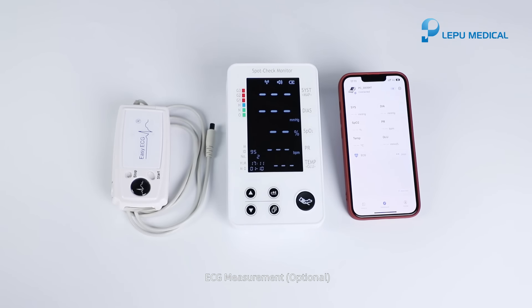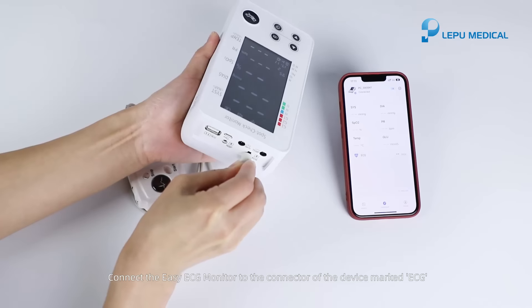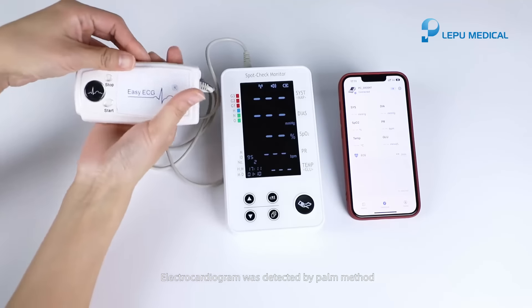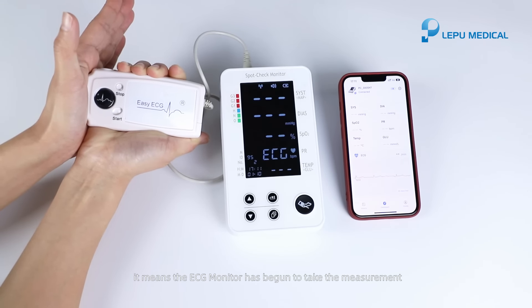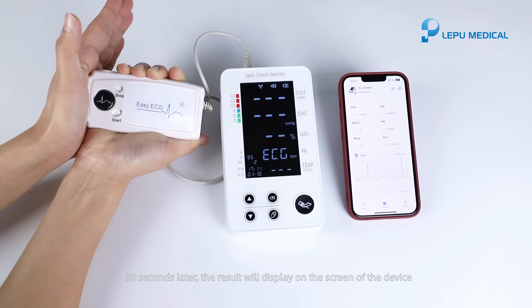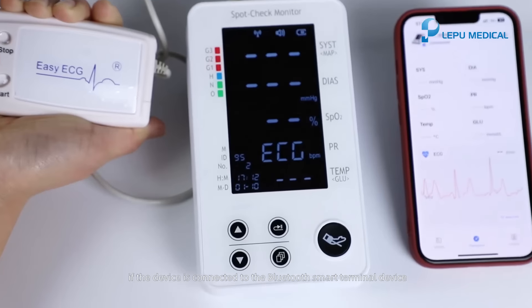ECG measurement, optional. Connect the easy ECG monitor to the connector of the device marked ECG. Electrocardiogram was detected by palm method. When the ECG displays on the screen of the device, it means the ECG monitor has begun to take the measurement. 30 seconds later, the result will display on the screen, and the result includes HR. Waveform will be displayed on the terminal device if the device is connected to the Bluetooth smart terminal device.